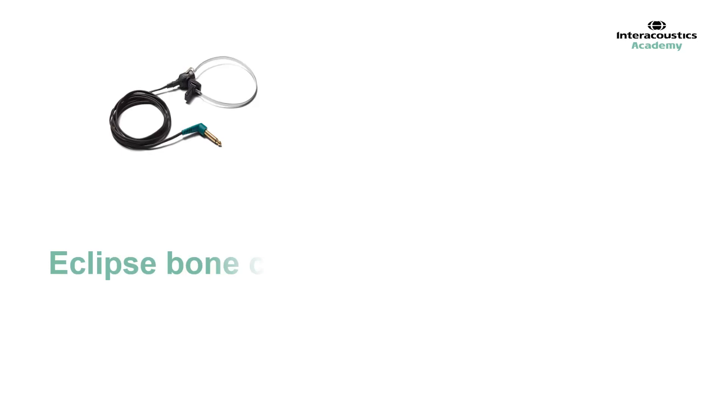There are two bone conductors available for testing using the Eclipse: the B71 and the B81, which allows for testing at louder intensities. When testing adults or older children via bone conduction, it is typical to leave the bone conductor attached to the headband and simply place this over the head as you would in normal pure tone audiometry.